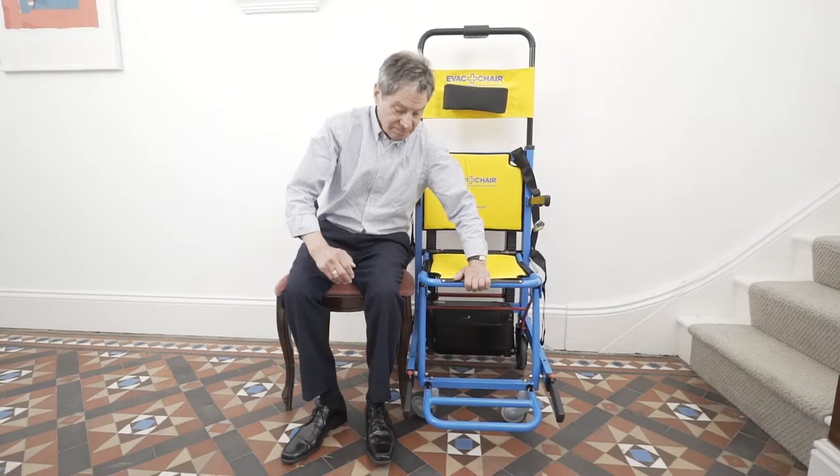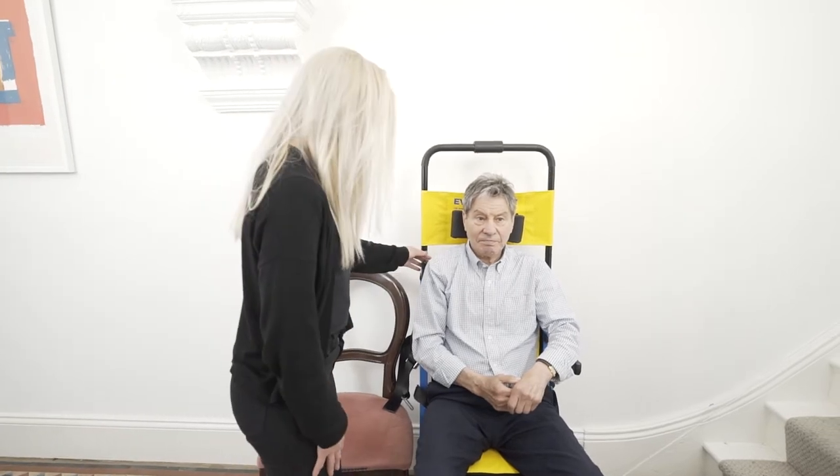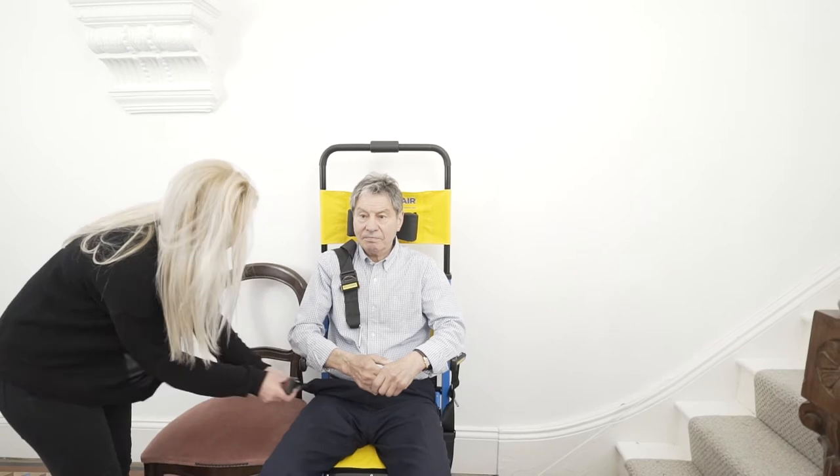The passenger can now be transferred to the seat of the chair. Once seated, the safety belt can now be fastened. On transferring, the occupant can self-transfer or can be transferred in line with guidance from their healthcare professional.